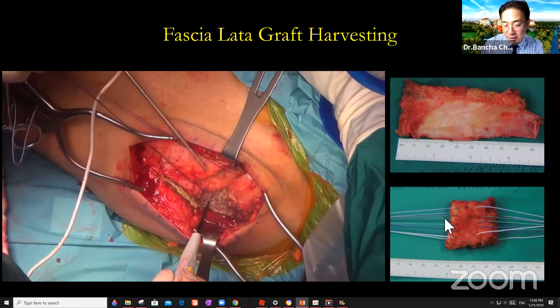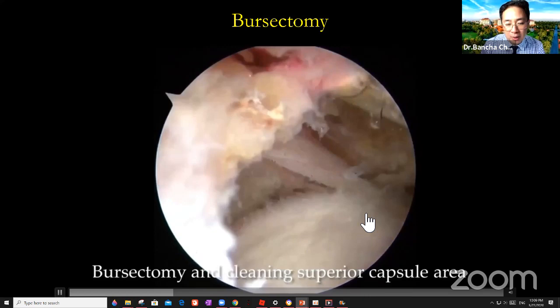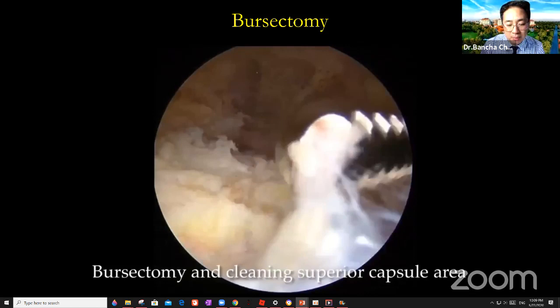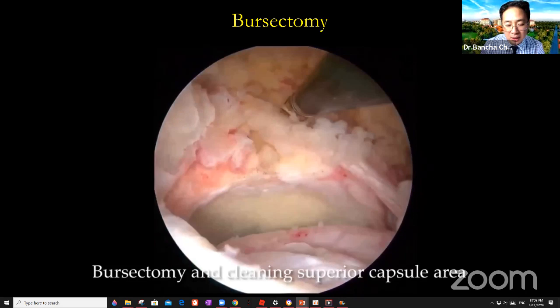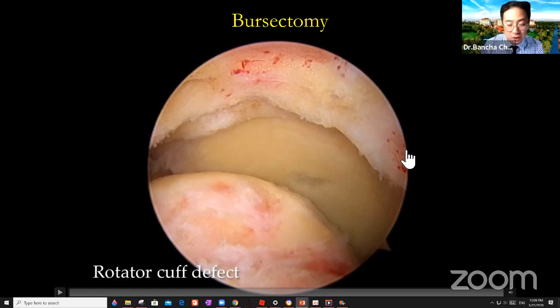So after that, yeah, we're cleaning the bursal side, remove all the bursal tissues, okay, stop the bleeding. Okay, this is quite important to make it clean. So this takes you some time. And also cleaning the soft tissue at the glenoid, subacromion, cleaning until you get this. You clean the tuberosity and bursal tissues.